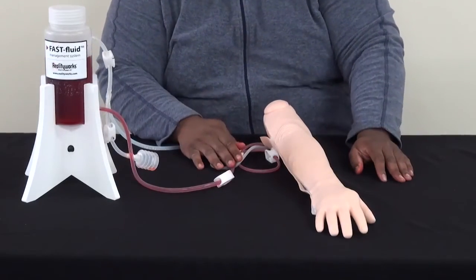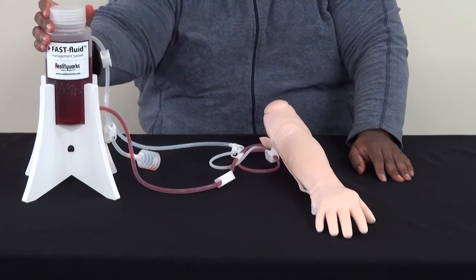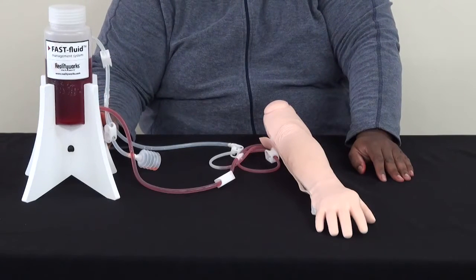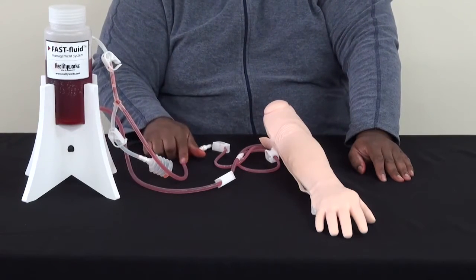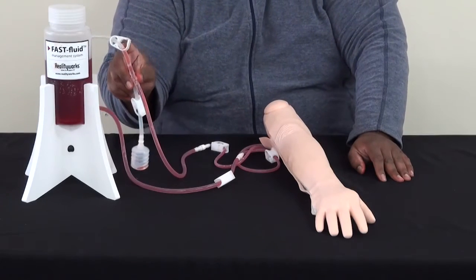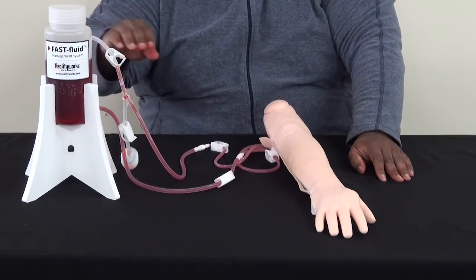Sometimes it takes a little bit for the fluid to get moving. You can release the top of this a little bit, just let a little air through to make sure it doesn't lock up. It can take a little bit for it to get all the air bubbles out, but you'll know it's just about done when the level of the liquid in the tube is about even with the level of the liquid in the tower itself.